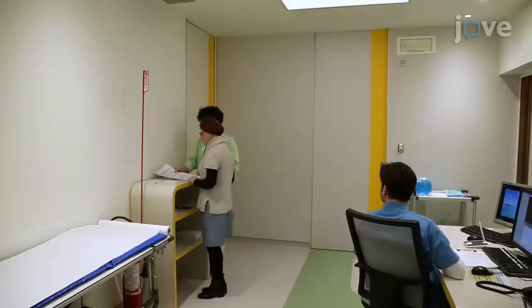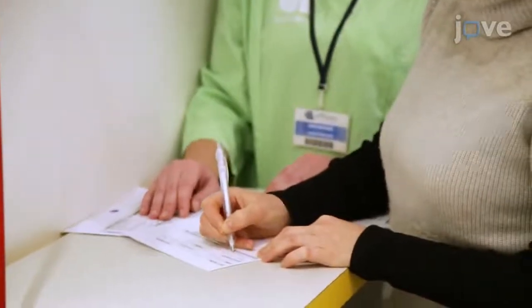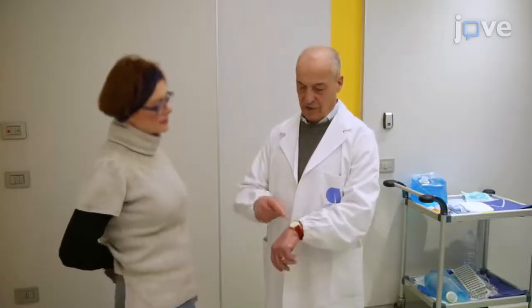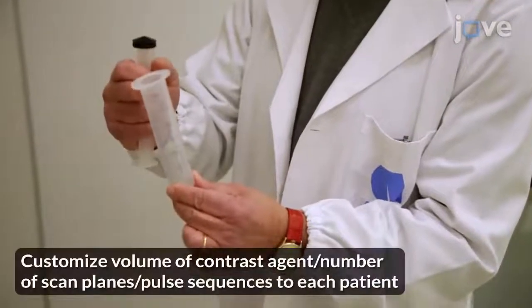Help the patient fill in a form that provides information on their history, current symptoms, treatments, and prior medical records, if any. After obtaining written consent, clearly explain the characteristics and purpose of the procedure, including the performance of the various examination maneuvers such as squeezing, straining, and rectal emptying to the patient, informing the patient of the on average 25-minute duration of the procedure and the need for the insertion of a small catheter into the anal canal for contrast administration.